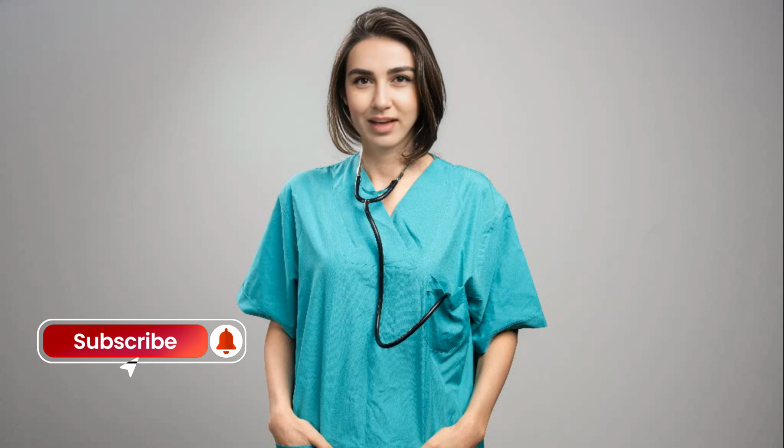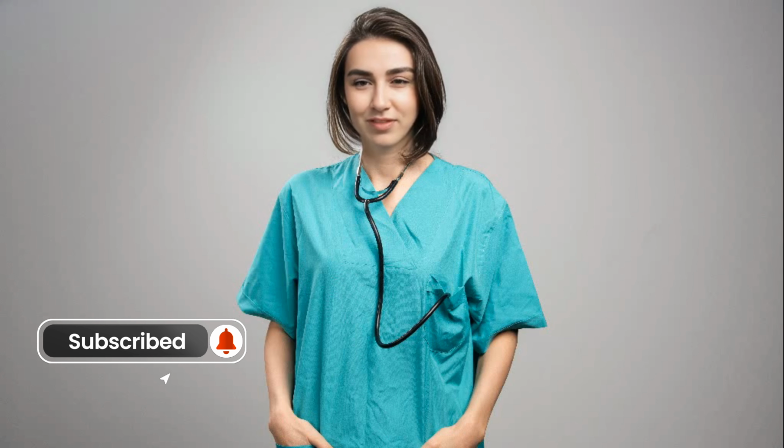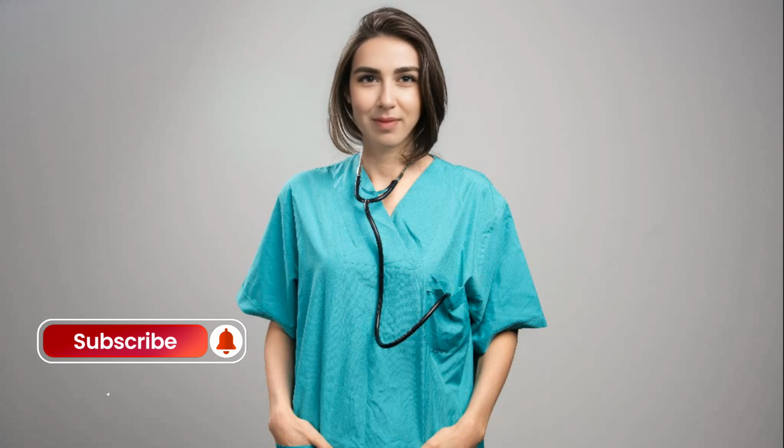3. Stent placement if necessary. In many cases, a stent, a tiny, expandable metal mesh tube, is placed over the balloon and positioned in the blocked area. When the balloon inflates, it expands the stent, which locks into place inside the artery. Once the balloon deflates and is removed, the stent stays in place to keep the artery open. Stents can be bare metal or drug-eluting, releasing medication over time to reduce the risk of re-narrowing.